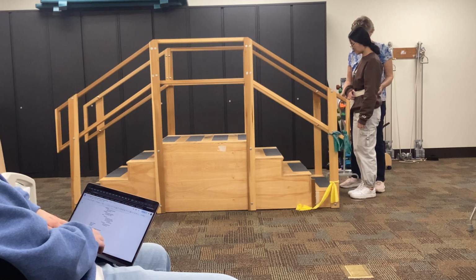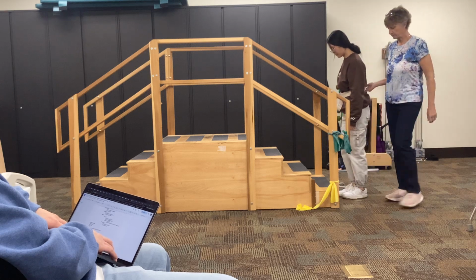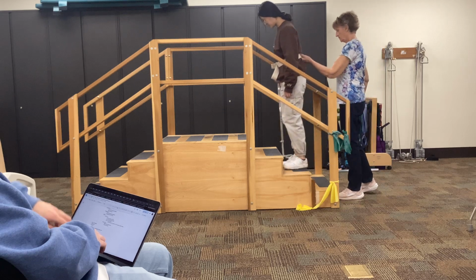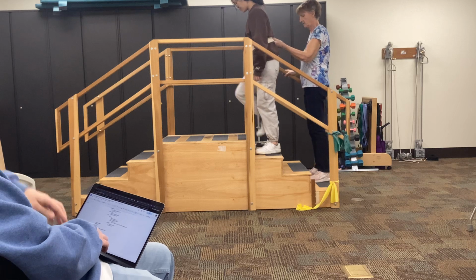So once they get up to the stairs, gonna have them turn it flat side against the riser of the stair, okay? And then proceed as you should. Again, making sure that all 4 points are on the stair.